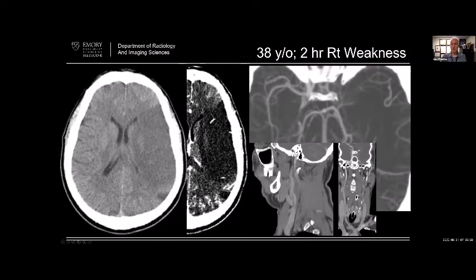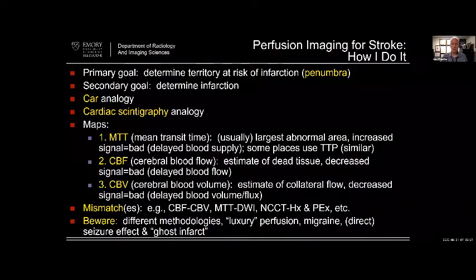So you can anticipate that they'd have an arterial dissection by their young age, but that also sets you up for success if you anticipate. So I'm big on anticipation. If I see something that I don't anticipate, then I sort of take a moment and think, what have I missed? And sort of look back and try to understand it better.